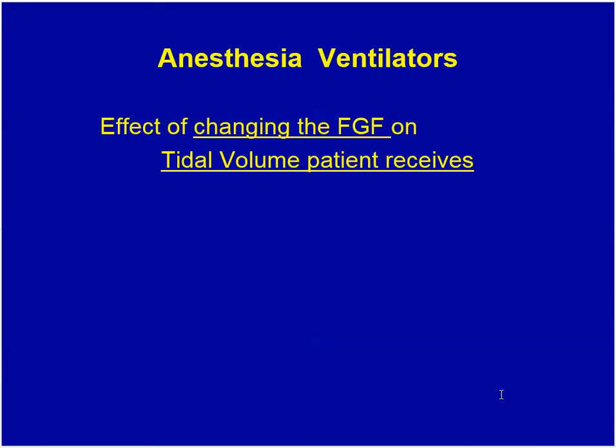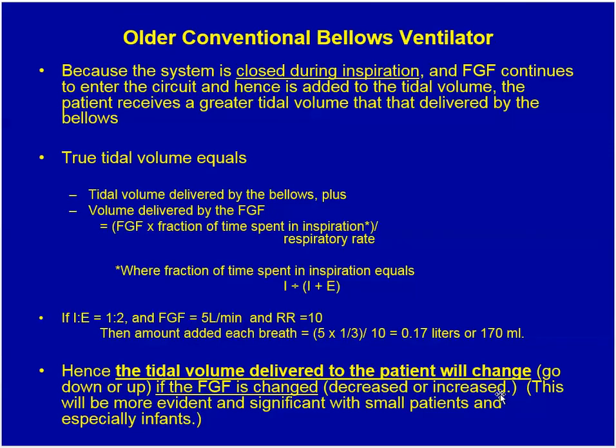Now, a topic that comes up, at least in the past, is what is the effect of fresh gas flow on the tidal volume that a patient receives. This was an issue with the older conventional bellows ventilators. This is because the system is closed during inspiration, and therefore any fresh gas flow that enters the circuit during inspiration is added to the tidal volume. And so the tidal volume is not only the volume delivered by the ventilator, but also by any additional volume added by the fresh gas flow.